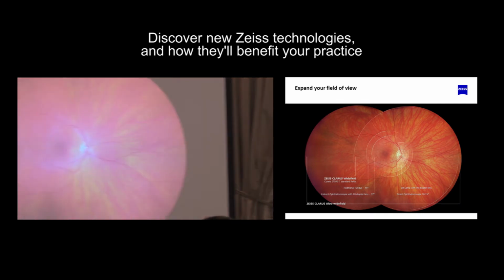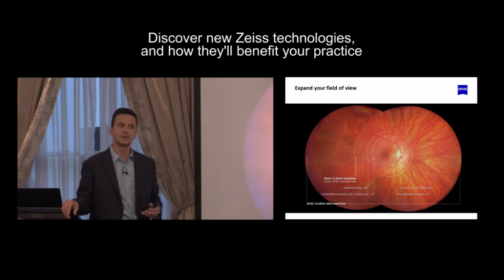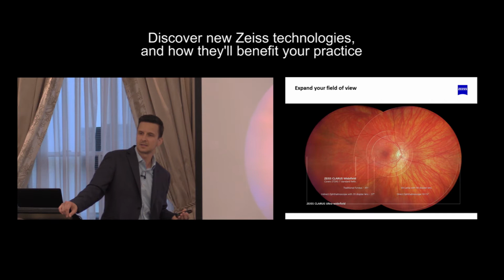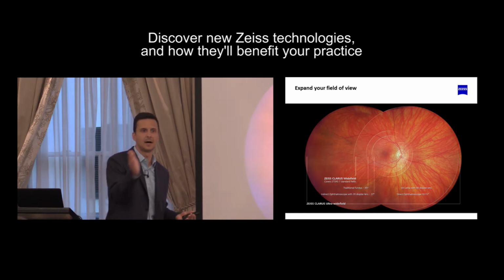On a 2.5 millimeter pupil, we did see with these patients that it seemed to take about 3.5 plus minutes on acquisition. Whereas if we had a pupil that was at 3 millimeters, it took us 2 minutes or less in terms of total acquisition time for the staff from eye to eye to eye.